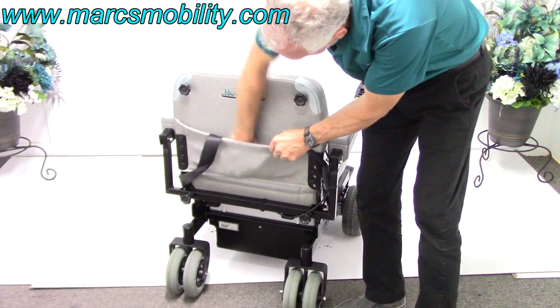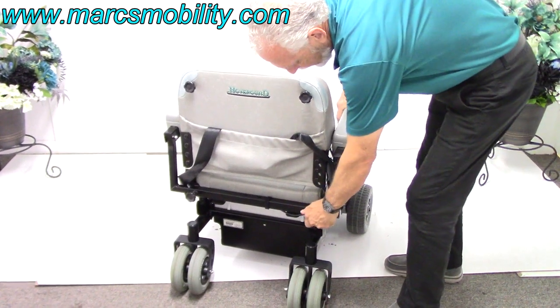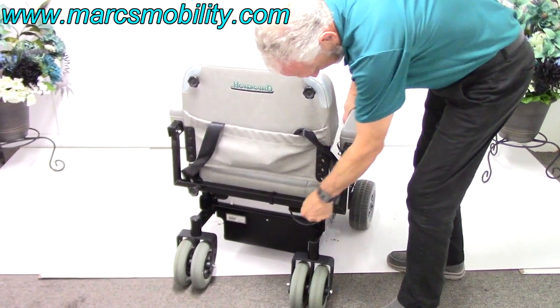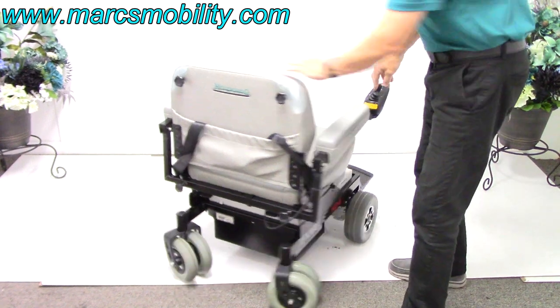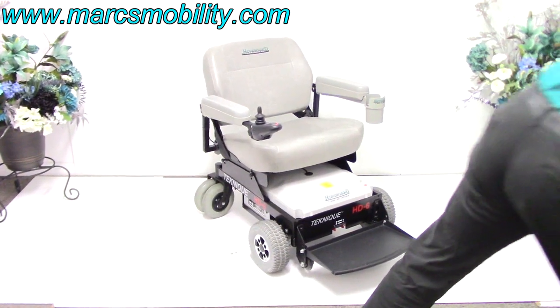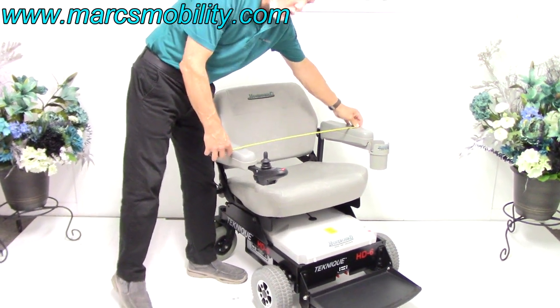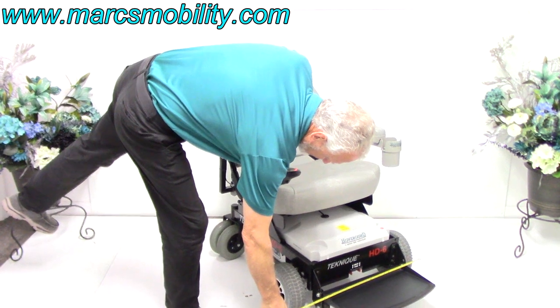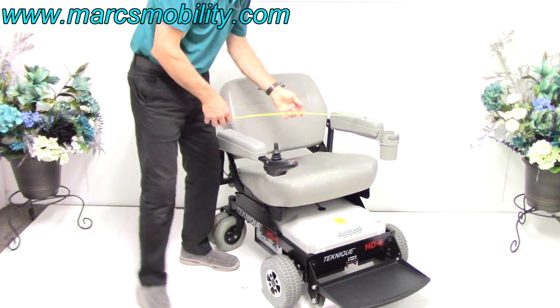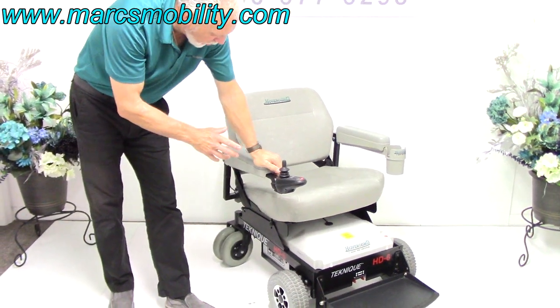And you can see how well constructed this chair is. You can see the arm on this chair also will go out if you need more width. If you turn this knob, you can pull the arm out if you needed more width. So this chair is about 28 inches wide. So remember this for your doors. Right here, because of the seat, this is 28 and a quarter, and the chair itself is 27 inches. So 27 inches from outside of wheel, but your arms are at 28. So remember that, these arms are 28 inches wide. So if you got a small home, just remember that.